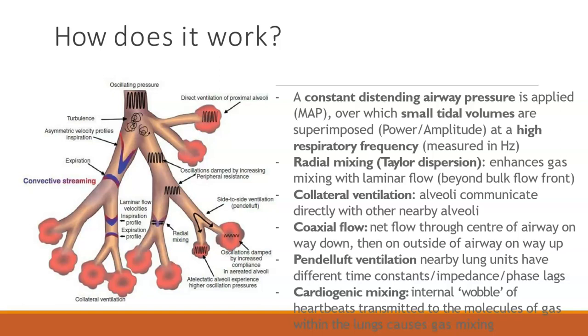And then there is this radial mixing where the gas mixes with laminar flow and goes straight down the middle. You'll see in other books or textbooks how the gas is going straight down the middle of each airway, just pushing straight on through. It's kind of like the way Vapotherm works: it's just flow, but the patients can have these crazy high flows and they don't need help exhaling.